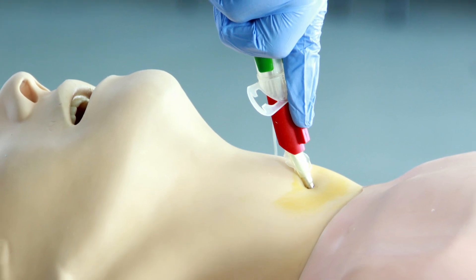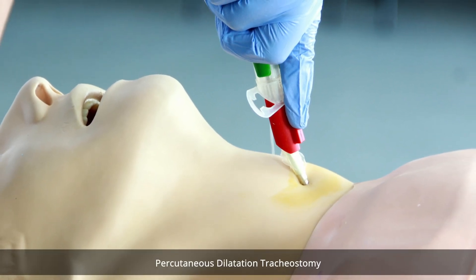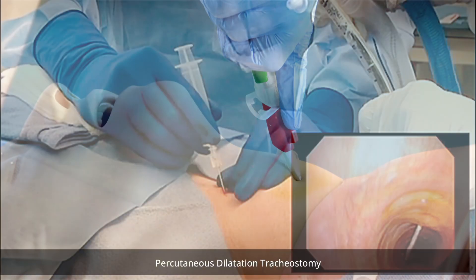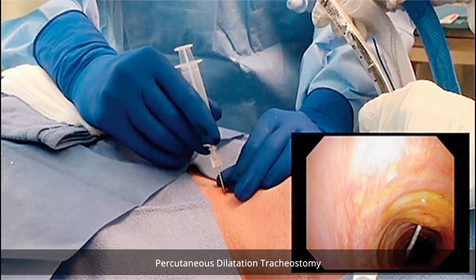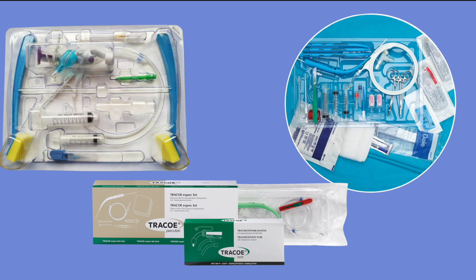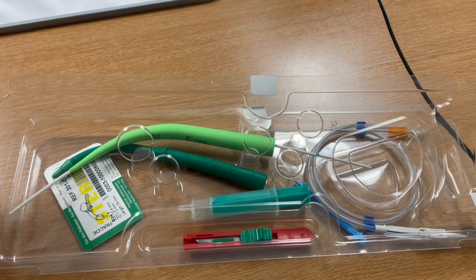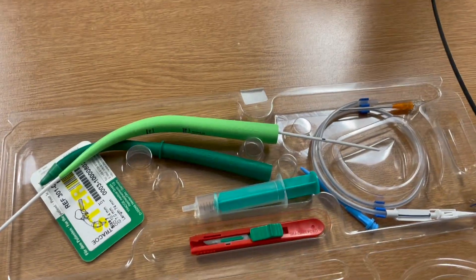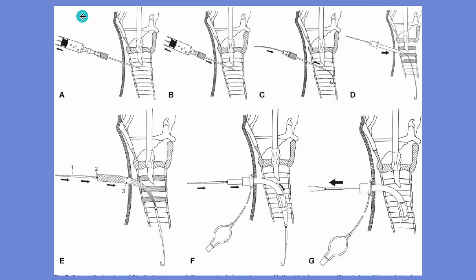Another method, which is common in the intensive care unit, is the percutaneous dilatation tracheostomy. This will be done at bedside. The kits may look similar or different depending on company or manufacturer, but at the end they all do the same job.